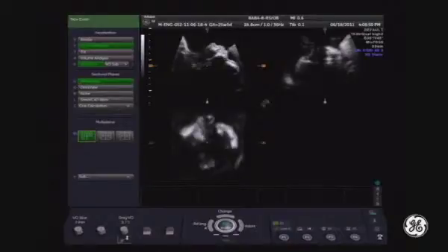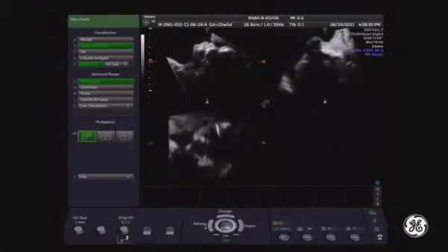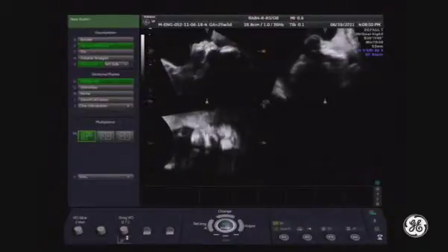I will turn the sagittal view of the palate vertically to bring it vertically by z-axis. And now the pivot point is placed exactly at the middle of the palate.